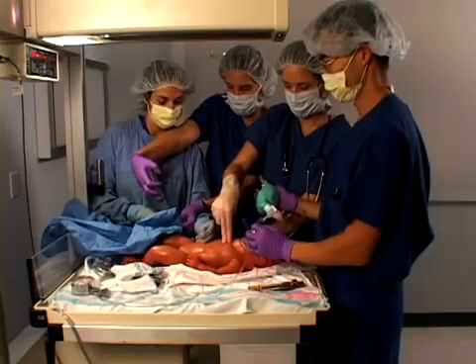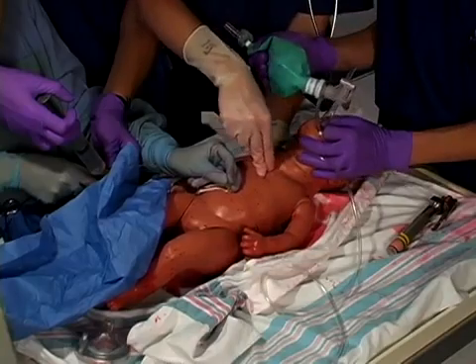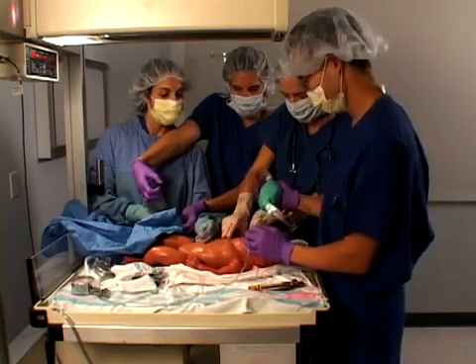1 and 2 and 3 and breathing. 1 and 2 and 3 and it's about half in. Breathing on her a little bit. It's like starting to make some effort. Okay, let's go ahead and reassess her.